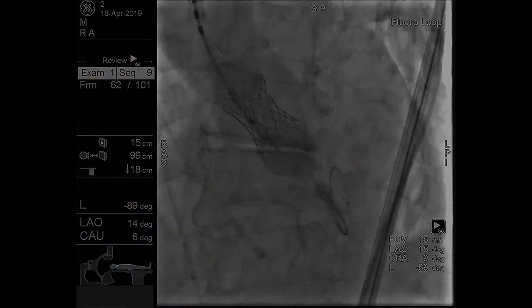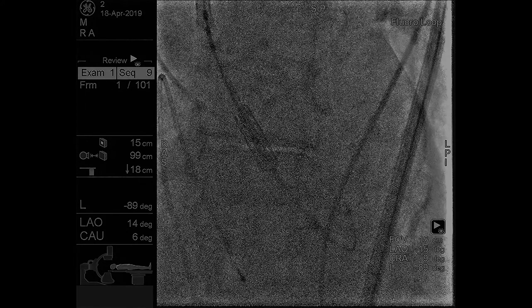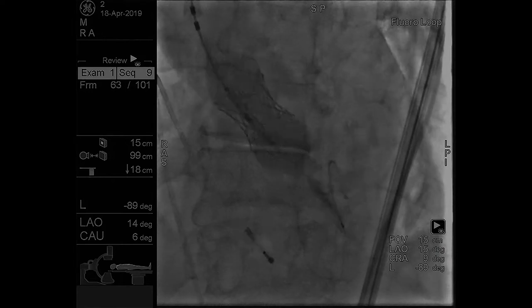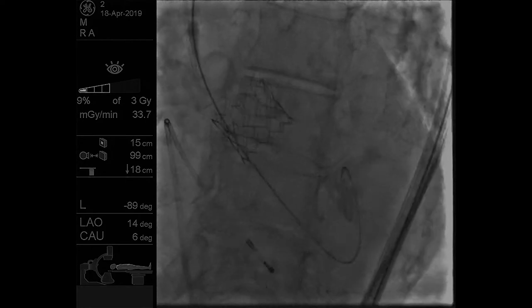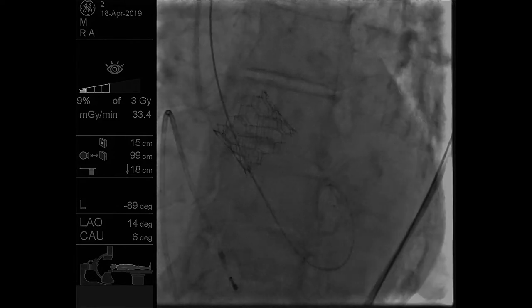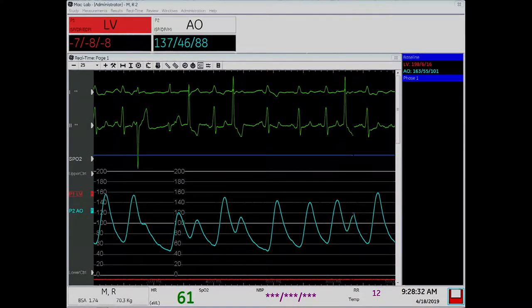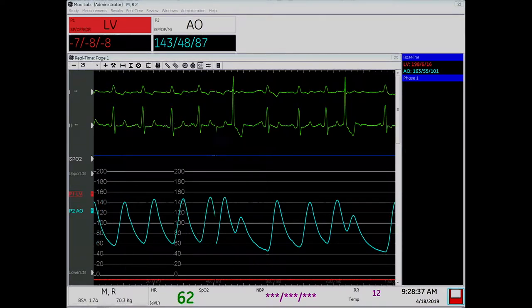We overdrive paced, and you can see how the valve really comes in from the bottom. The bottom really comes up when it's deployed. As you can see, whoop. Yeah, okay, looks good. That's always a fun moment. We'll take this out, and then we'll measure some pressures, and we'll see if there's any regurgitation. As you know, this valve has a skirt that's really phenomenal, that tends to block paravalvular leak.